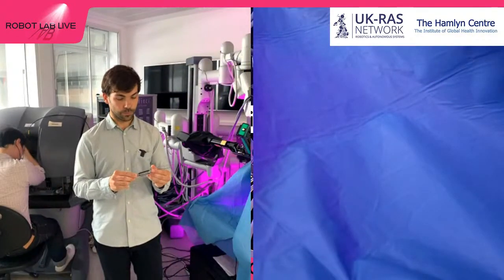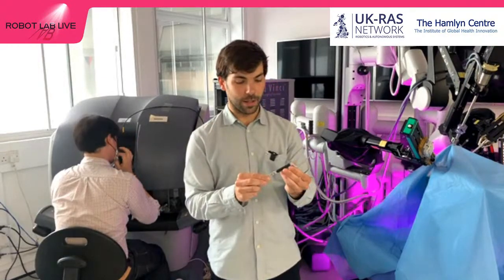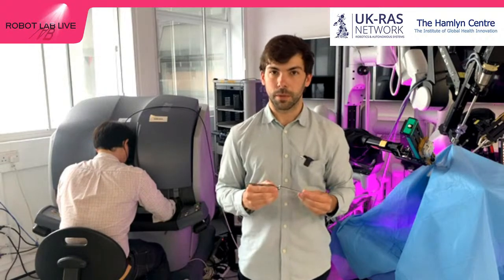To give you an idea of what robotics can do, this is a tool that is used in neurosurgery. This tool is used to remove tissue from the way, or to pick up something. But you know that the brain is very delicate, right? So we want to do this in a very accurate and soft manner. But sometimes the forces that we have to apply in order to not damage the tissue have to be very, very small, right? And it's here where robotics can actually help.